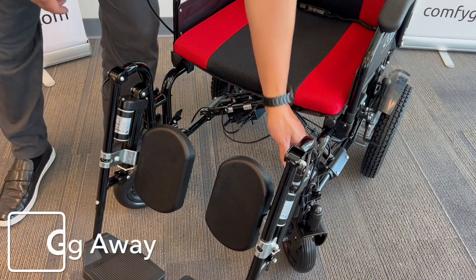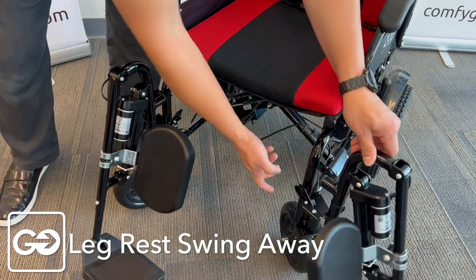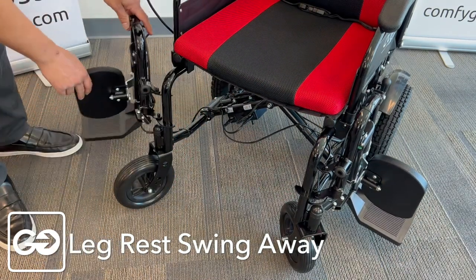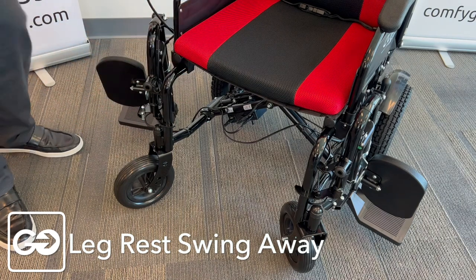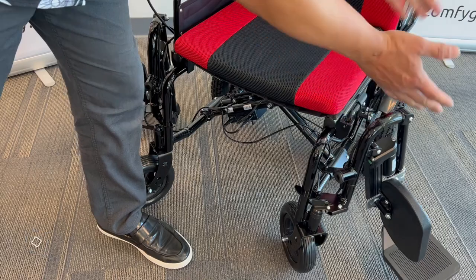We also have the ability to swing these leg rests out for easy access. Just pull this tab here on the side to open up the left side, and pull this tab to open up the right side. This will allow a user to get right into the chair, and in combination with our armrest flipped up, you can see there's a lot of access to the chair.